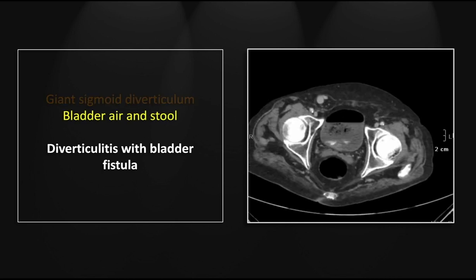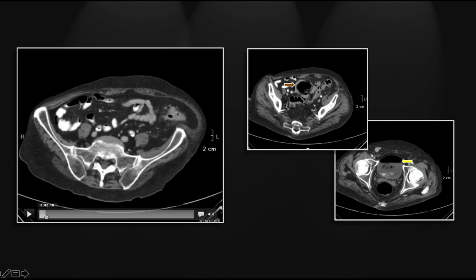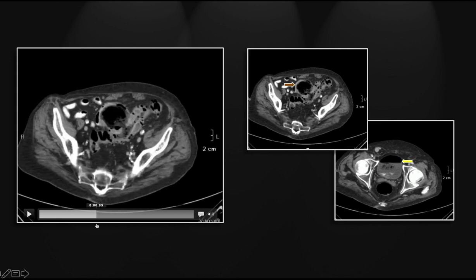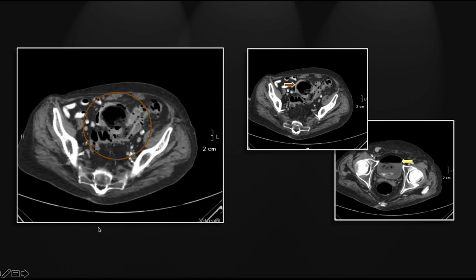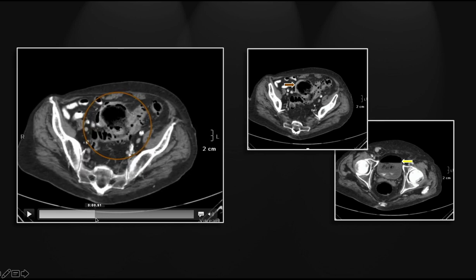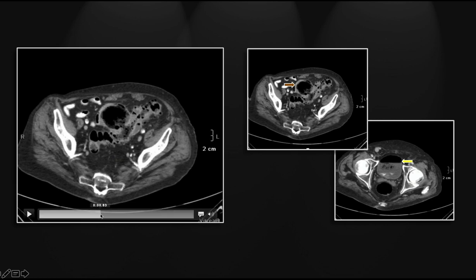In the bladder, there is a very obvious gas-fluid level as well as intraluminal hypodensity consistent with stool. Posteriorly, there is normally excreted contrast. Let's look first at that giant sigmoid diverticulum, its heterogeneous wall thickening, and that defect at its base which communicates with the sigmoid lumen. Note again the sigmoid diverticulosis and wall thickening.